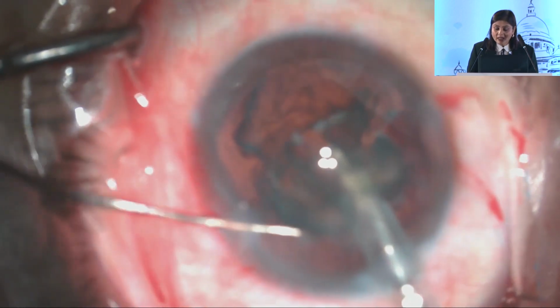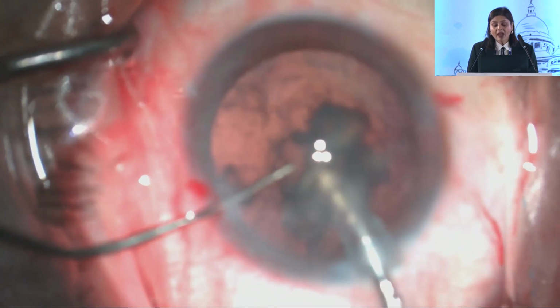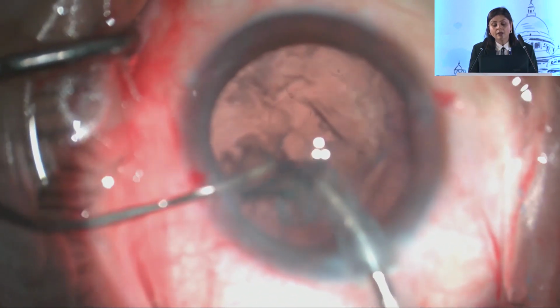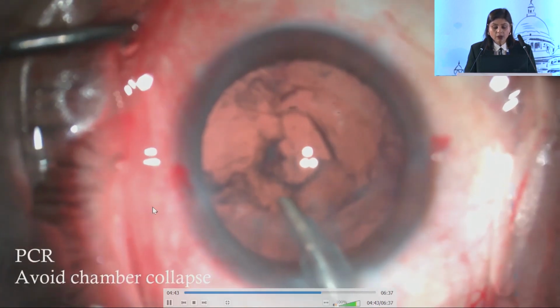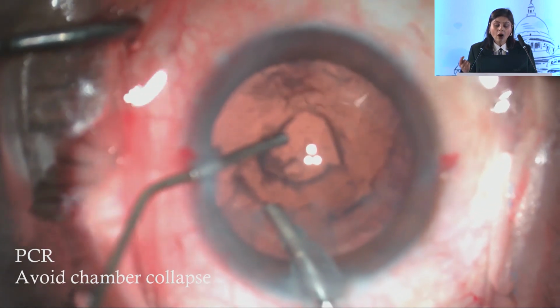Now, as soon as we prolapse this whole anterior epinucleus plate, and once we remove the anterior epinucleus plate, I realize that there is a posterior capsular rupture. We can see here superiorly that there's a posterior capsular rupture, and what we need to do is stay calm and make sure that we don't withdraw our phaco probe.